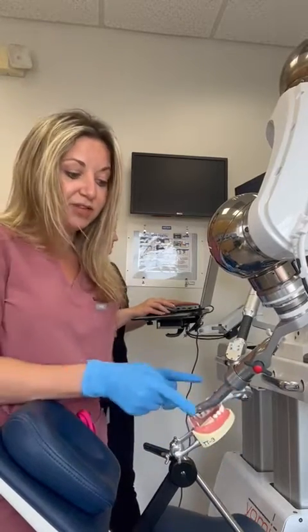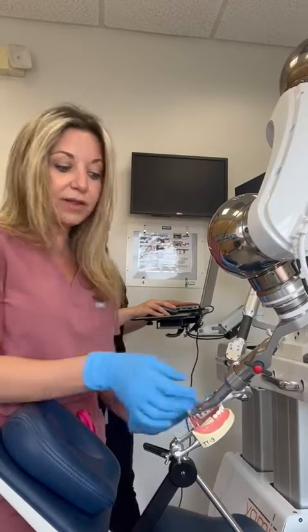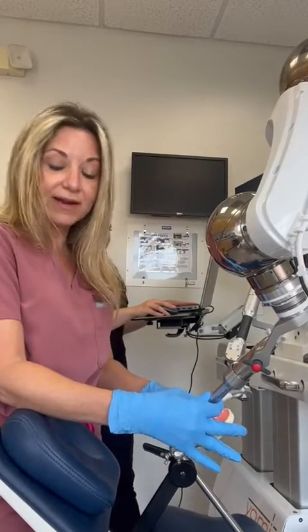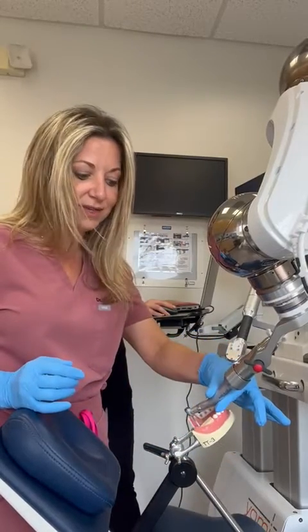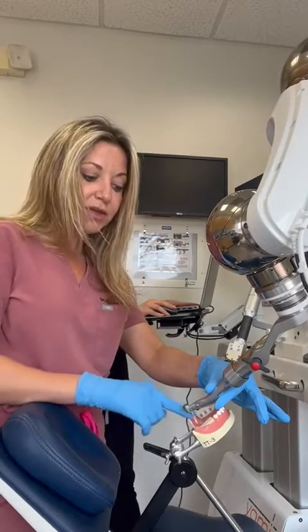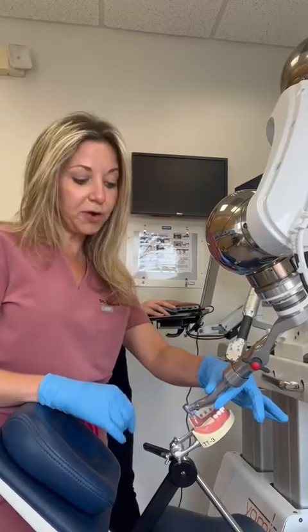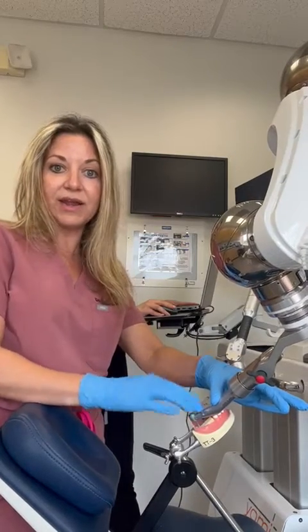So that means we're in the correct position. As you can see, this handpiece is not moving on the patient, and this is going to prevent less error. So we're going to go ahead and start drilling. We're at depth already. The Yomi is measuring exactly how far we need to go, and as I'm pressing, I can't press any harder.